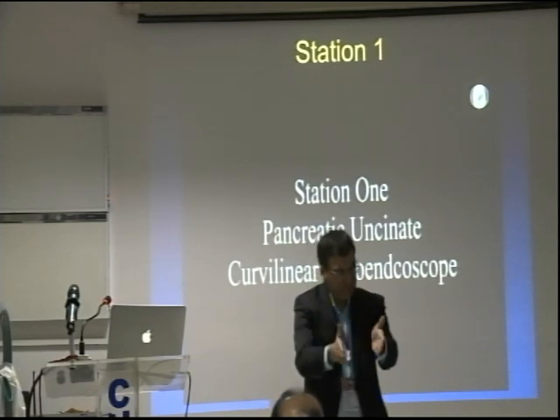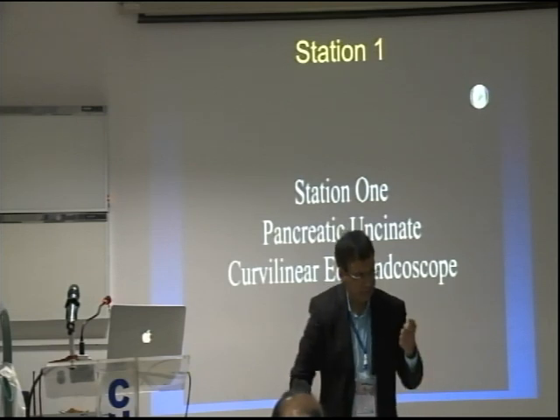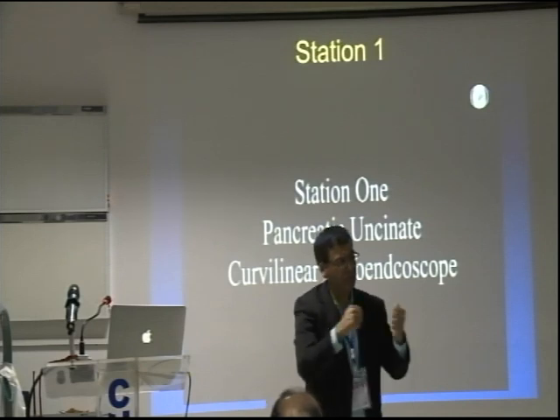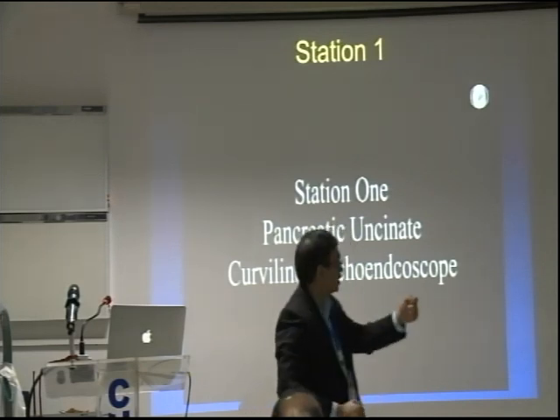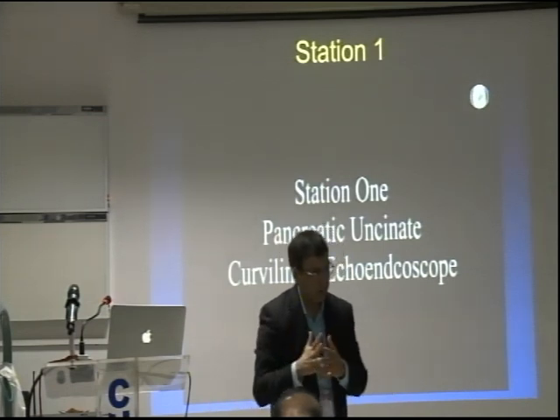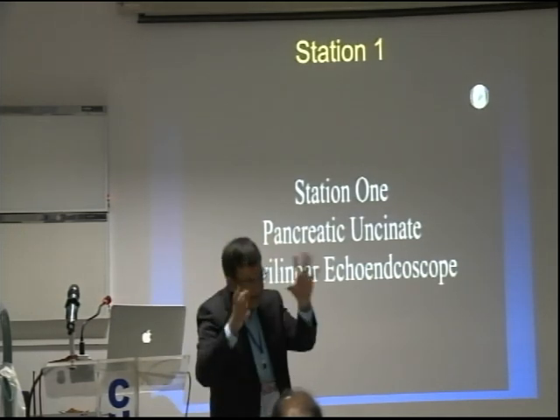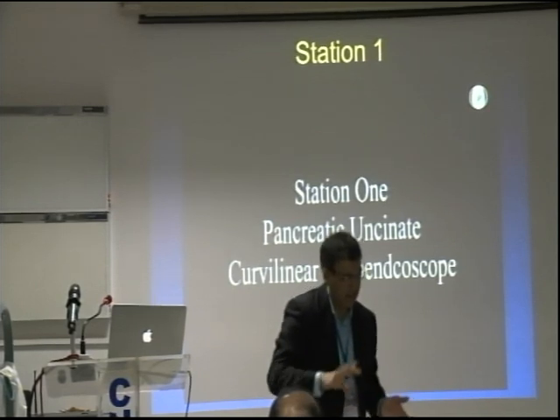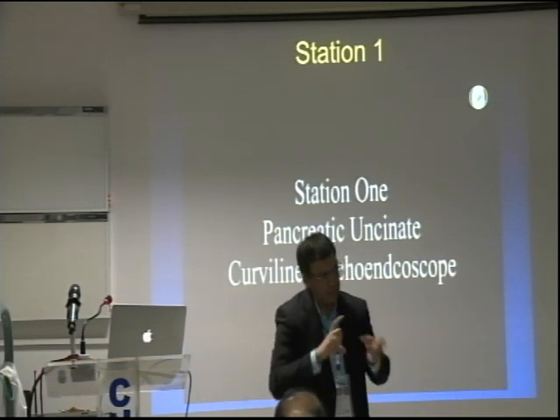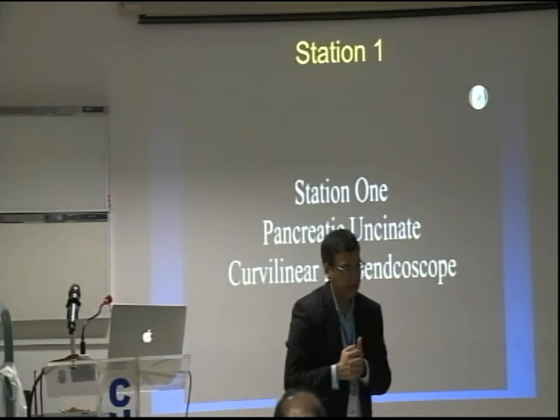The second way is you go to the descending duodenum. You don't look at anything. You just suction the air out, and then move your scope right and left. This is the area where you move your scope quite a bit until you find the aorta, and then you find those 5 structures. So you can do it under fluoro. It gives you a little bit of an idea in the beginning of what you are doing with the scope and what the position of the scope is. It's a part of learning, whatever helps you to learn that, especially in the beginning. So that's it.